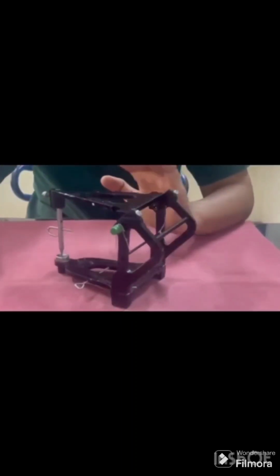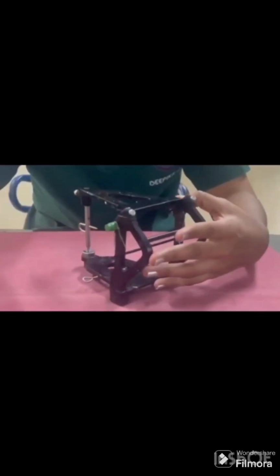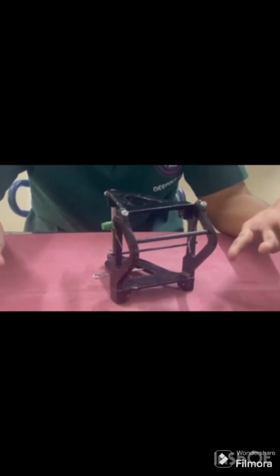What are the advantages of an articulator? It provides a better view of the patient's occlusion, especially the lingual side which cannot be seen in the patient's mouth. The patient's tongue, saliva and cheeks are not factors of hindrance while using an articulator. Some procedures can be given to the technicians if an articulator is used, and refinement is easy if articulators are used.